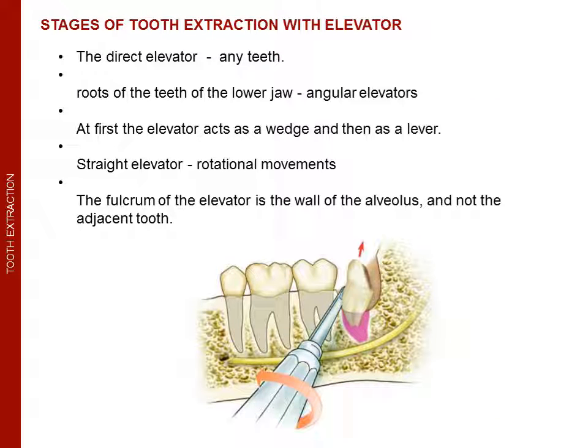Extraction of a tooth with an elevator. The use of the elevator is based on the use of lever principles. The direct elevator can be used when removing any teeth. To remove the roots of the teeth of the lower jaw, an angular elevator is used.